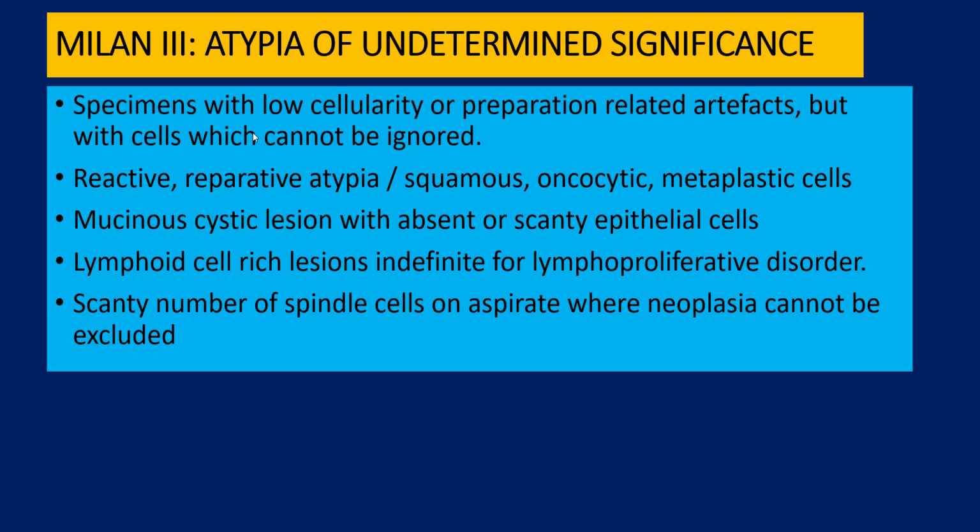Sometimes you can have reactive changes, reparative changes. I showed you sometimes you can see that in association with chronic sialadenitis, squamous oncocytic metaplastic cells.